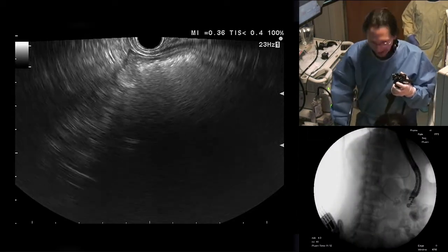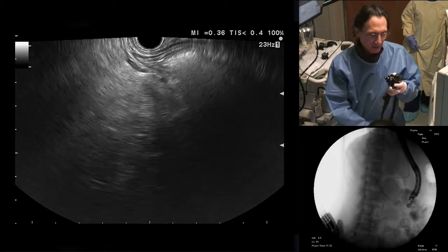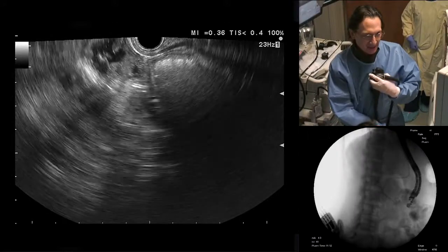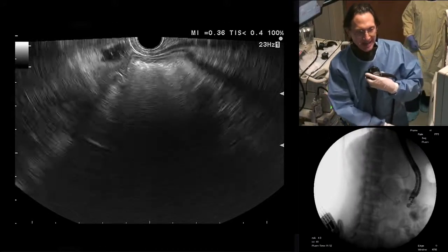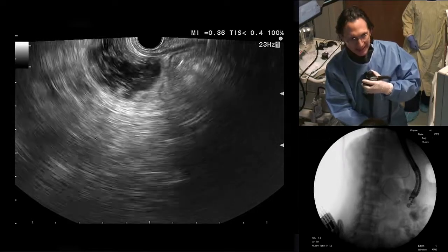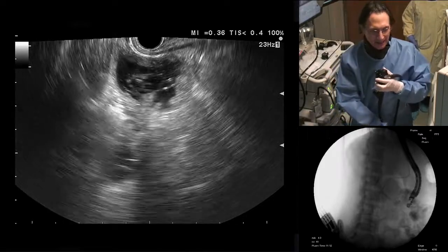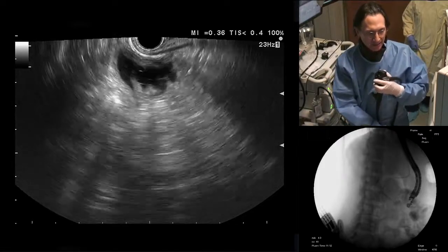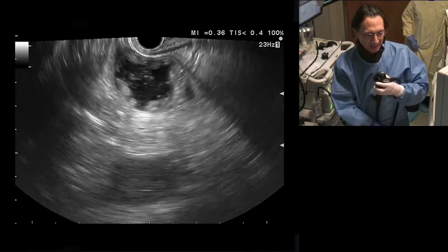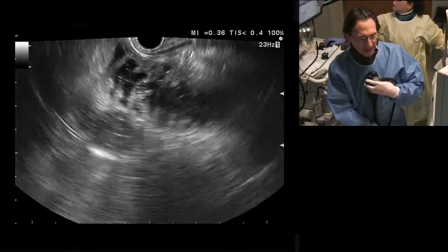So I'm going to press on the water pedal now and see if that starts to displace some of the air in the small bowel here. Interesting. Here's where it's filling, not here. So this is actually a neighboring loop of bowel, probably further down, jejunum, right? And this here that we're filling with the water, very nice. This is the distal duodenum. There, we see it nicely. We see the Kerckring folds here. It's very classic small bowel.